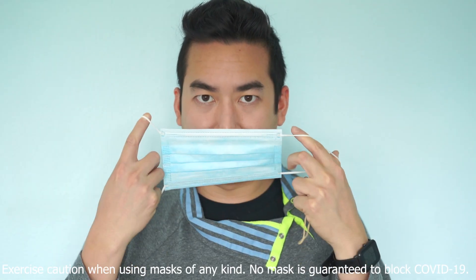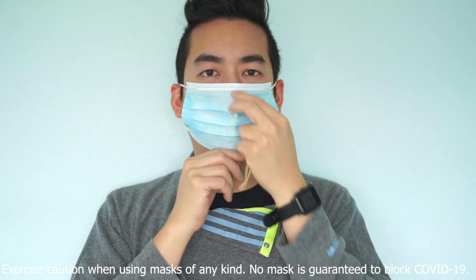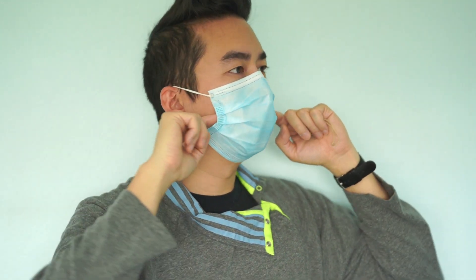So how you wear the mask is — normally you put it over your face, like so. Stretch the bottom to cover underneath your chin. And the top part, make sure it's over your bridge and you press in so that it's tight around there. You can normally see there's a gap here and a gap here where airborne particles can come in.